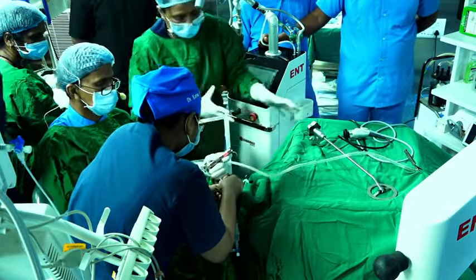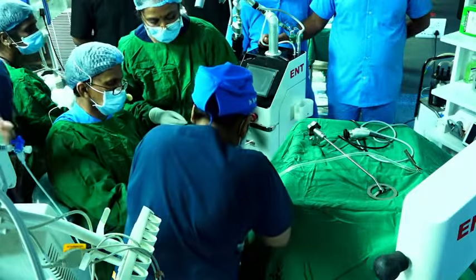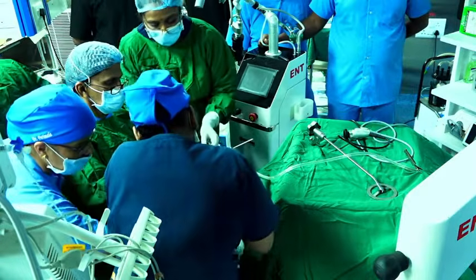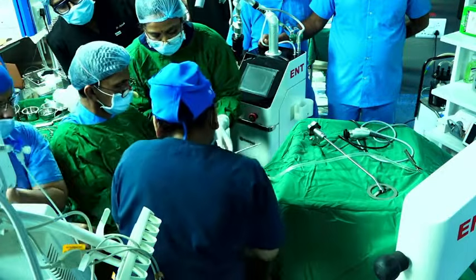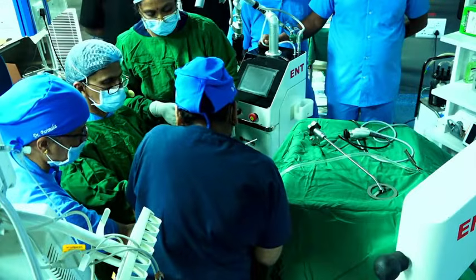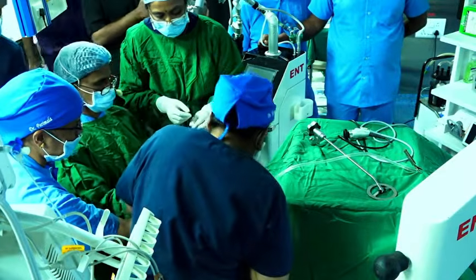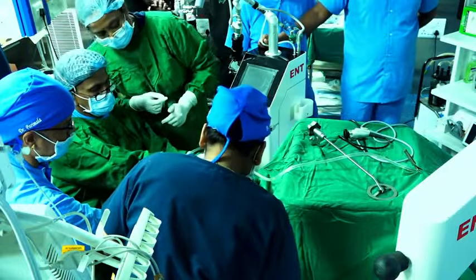Push, give suction. Don't pull it, madam. Don't pull it. It will come out. You have to hold it over. Now you remove. Disconnect.